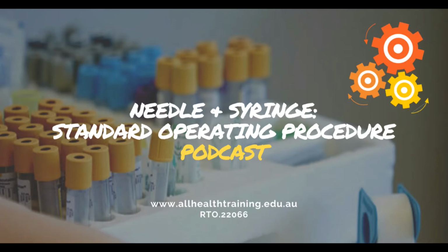Some tests require pre-test criteria questions. Some tests require fasting. Some tests require the patient to withhold medication, and some tests require the names of medication that they are taking. Fill this information in the clinical notes section on the referral. We are now ready to start the procedure.